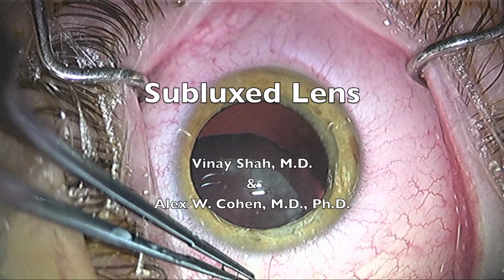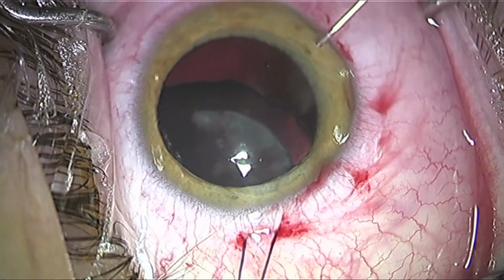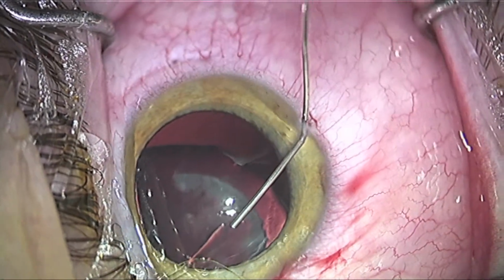This is a case that Vinay Shah and I did recently of a young man with homocystinuria and a severely subluxed lens. You can see here that there's about 180 degrees of zonular weakness. We began the case by putting air into the anterior chamber.